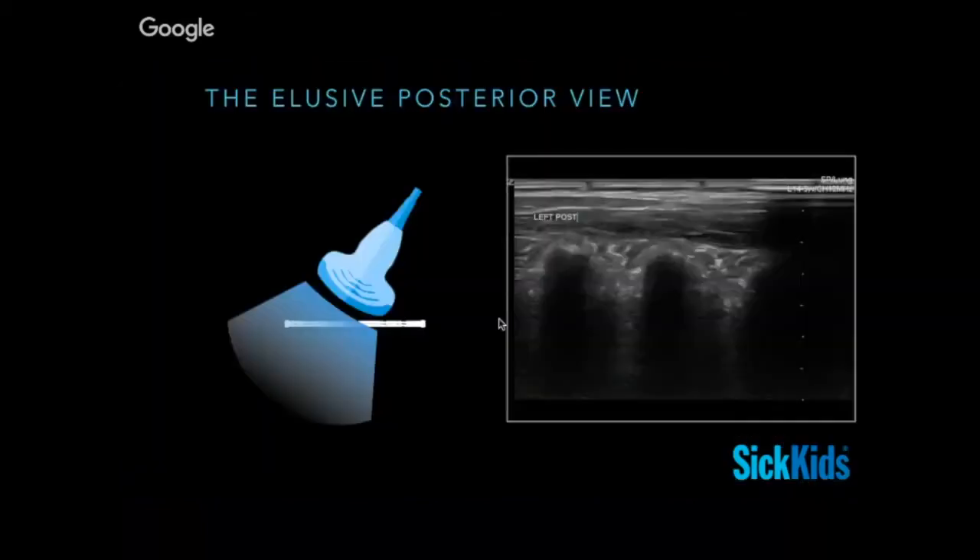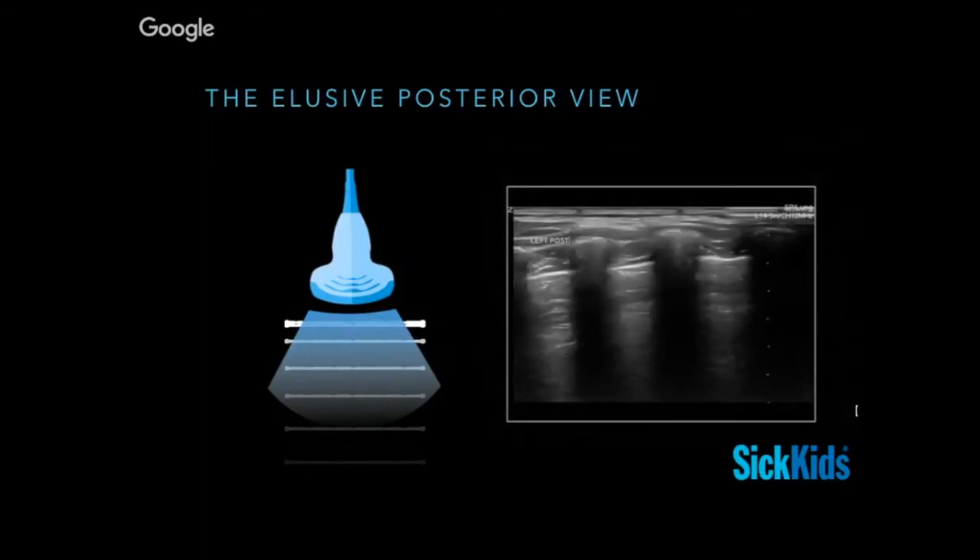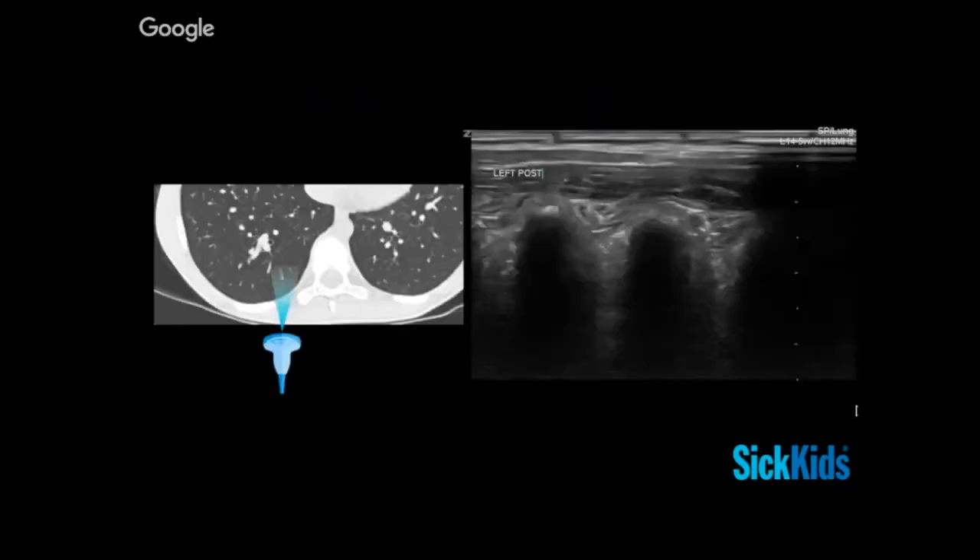Some tips about the posterior view — people struggle with it a lot. A common issue is getting an image when scanning at the back in between the spine and the scapula that shows no clear pleura, looking like disrupted or shredded pleura, but it's really just artifact from not having your beam hit the pleura at a perpendicular angle. Images like this at the posterior part of the patient are often a probe misalignment issue. If you manage to turn your probe to truly intersect the pleura, you'll get A-lines again.